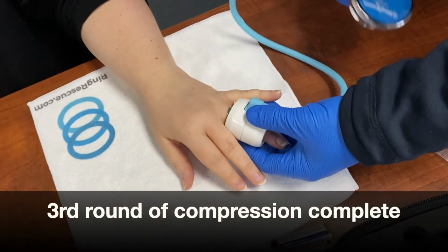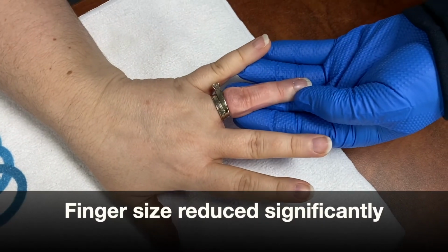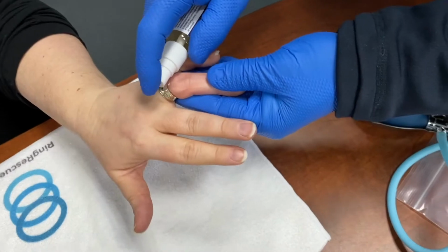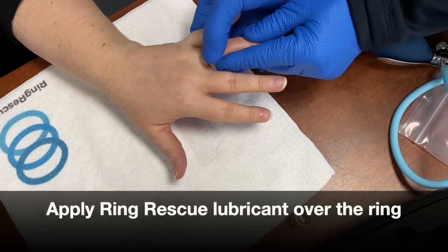Okay, so we're going to open the pressure up. Look at that skinny finger. That's awesome. The size came down so much, we're set up for success, I think, okay? There's still a little bit of skin bulge. We're going to put some lubricant on there. I'm going to do a couple sprays right underneath the ring. I'm going to rotate that ring around to make sure it's all freely moving, which it is.